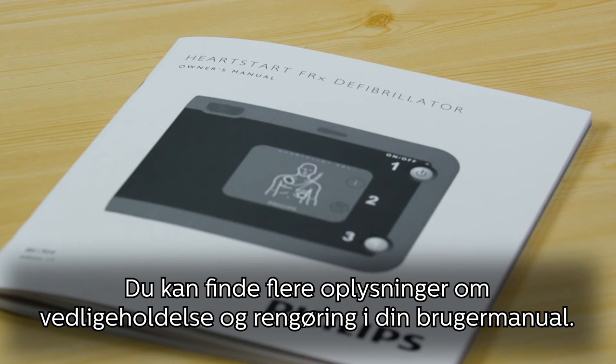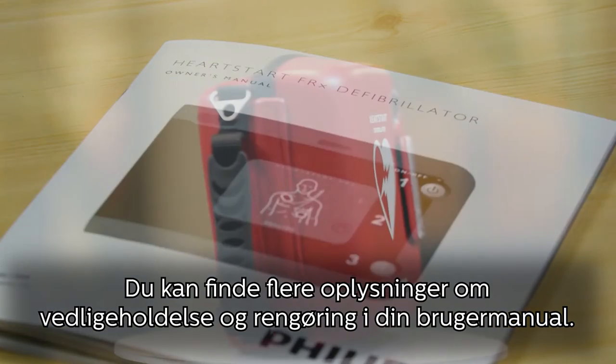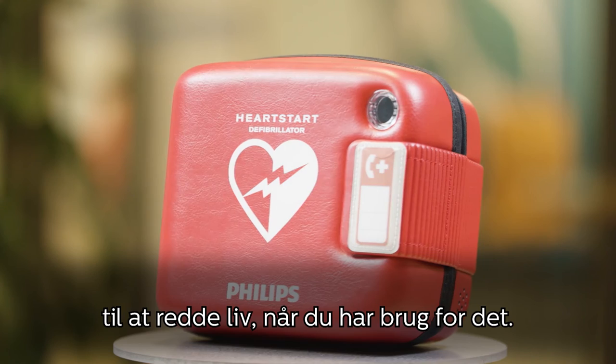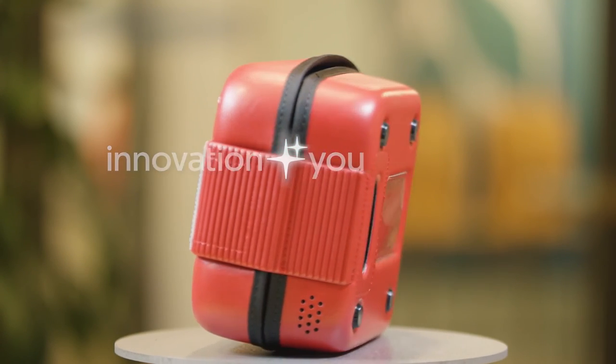For more information about maintenance and cleaning, check your owner's manual. Follow these few steps and you will ensure your HeartStart FRX is ready to help save a life when you need it. Philips — innovation and you.